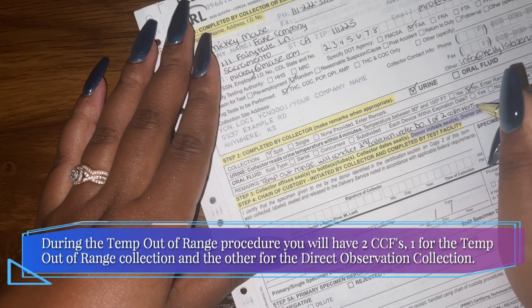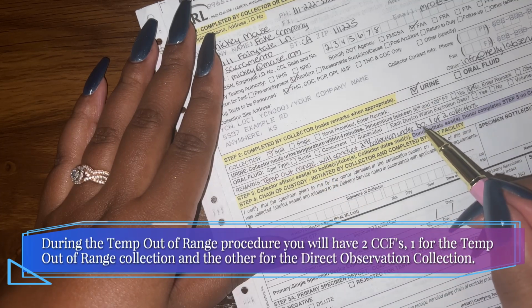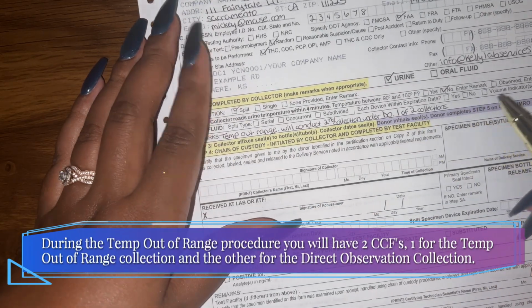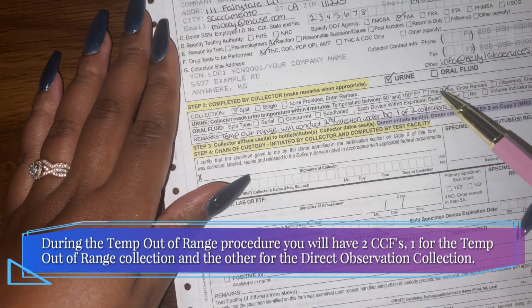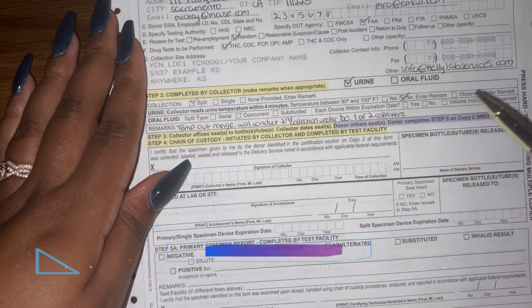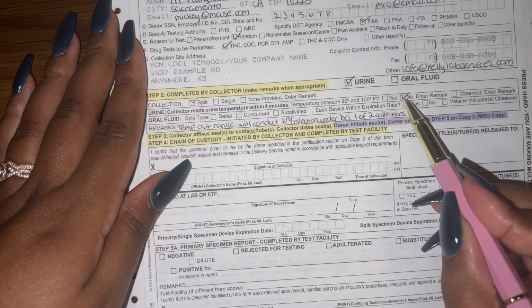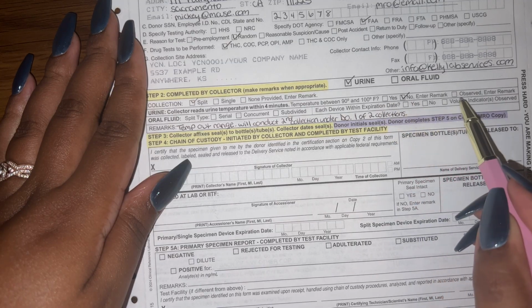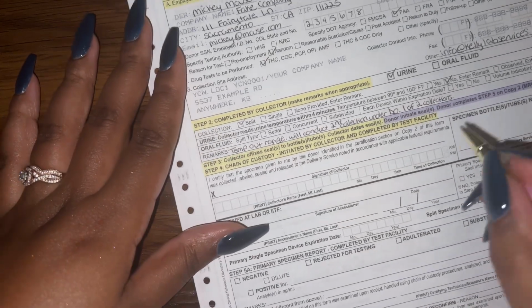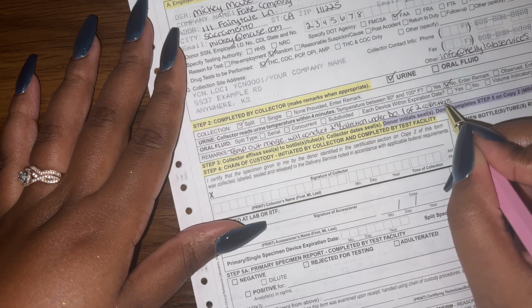We're telling them that because the temp out of range is its own collection, the direct observation is its own collection. So that makes this two separate collections, because you cannot document temp out of range and a direct observe on the same form, because it would not make sense. Okay, we cannot document that the temperature was out of range and that it was directly observed on the same form. We cannot do that. So we need to tell them this is the first of two collections.